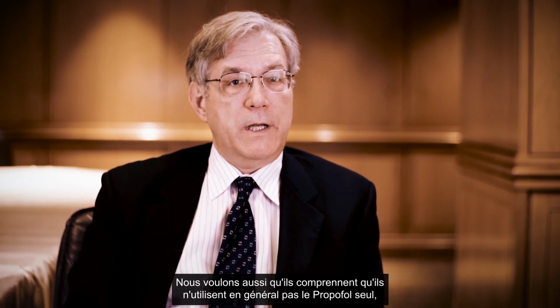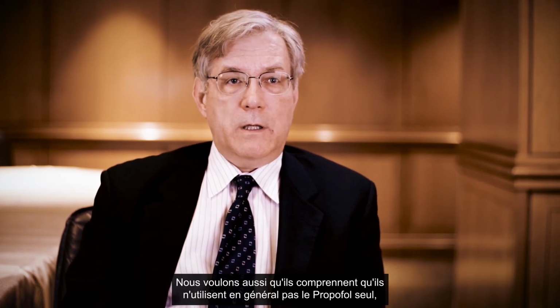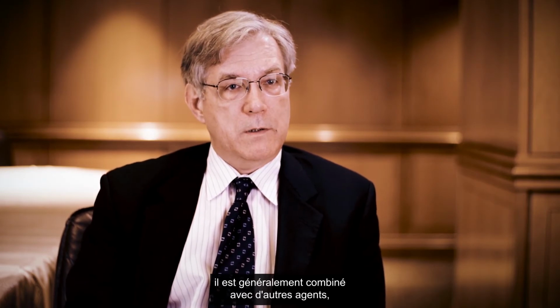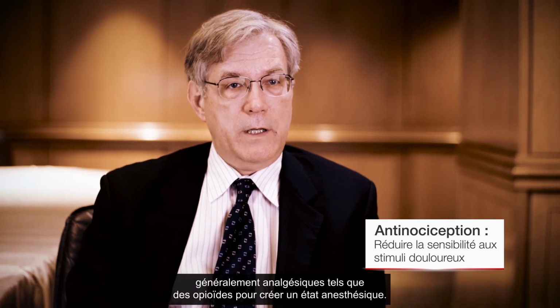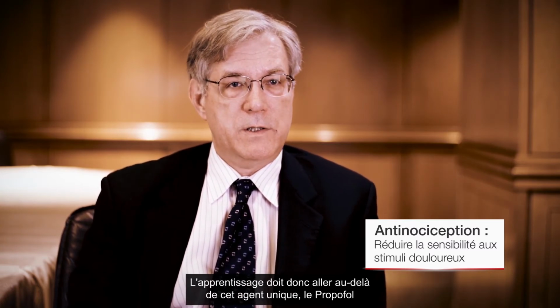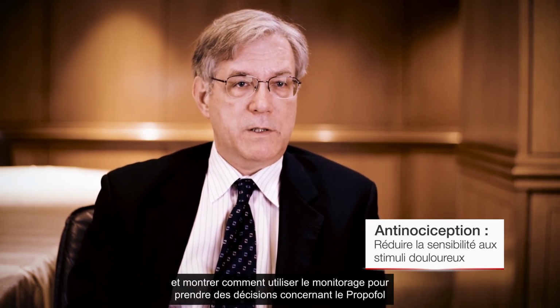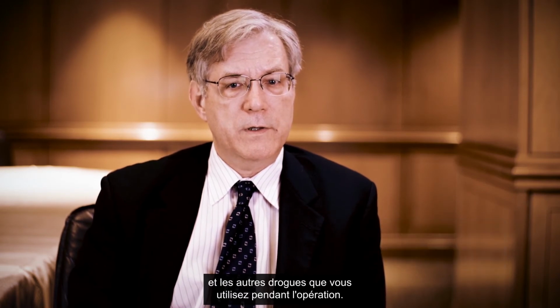We also want them to understand that they're not using propofol usually by itself. It's usually being combined with other agents, usually anti-nociceptive agents such as opioids, to create an anesthetic state. So the learning has to go beyond just this single agent propofol and how to use the monitoring to make decisions about propofol and the other things that you're using during the surgery.